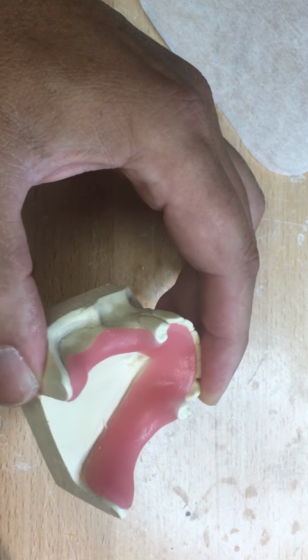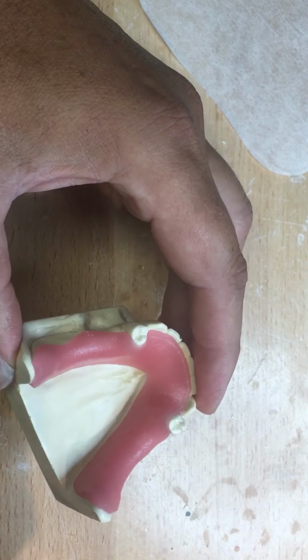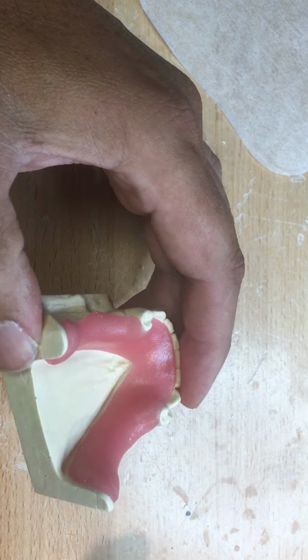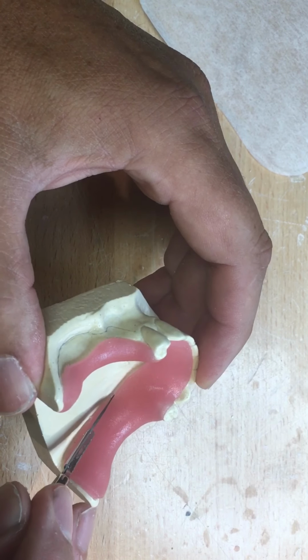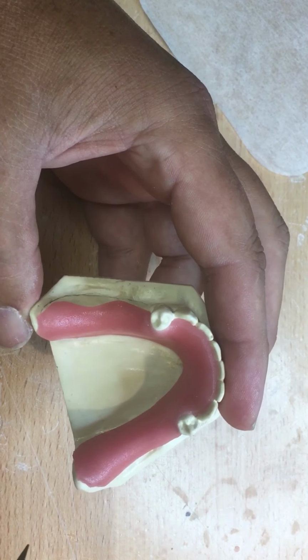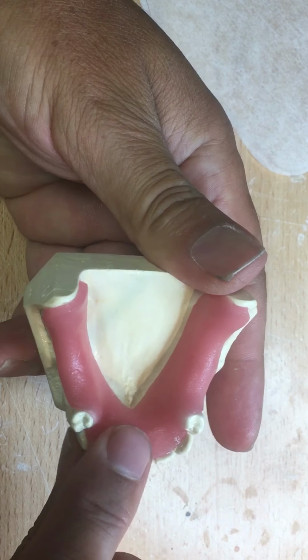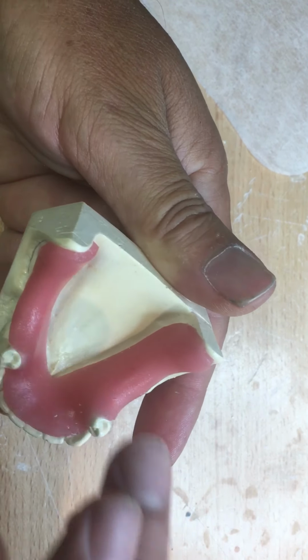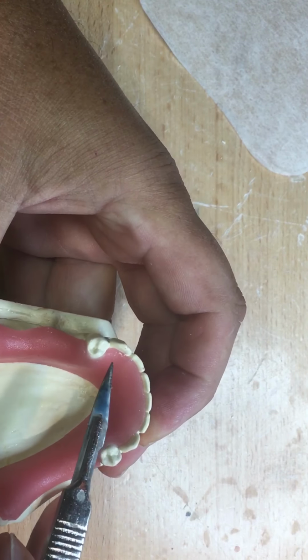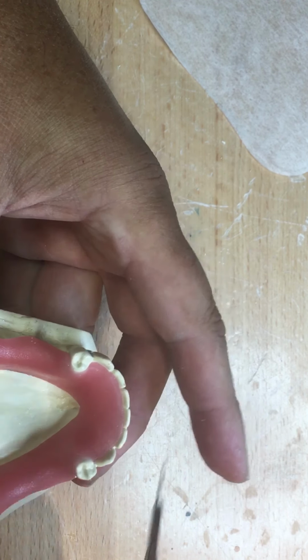Now again, I'm cutting on an angle which is perpendicular to the extension, so therefore I keep the width of the tray so it's not sharp. If we have a sharp tray in the patient's mouth, it doesn't take much to figure out what's going to happen with that sharp edge. And again, that sharp edge, I'm going to coat with base plate wax, making it even more pleasant for the patient's chairside experience. This is all going on behind the scenes. The dentist has no idea what I've done, except created a better experience for the client. They will just be reactive to what the client is saying.